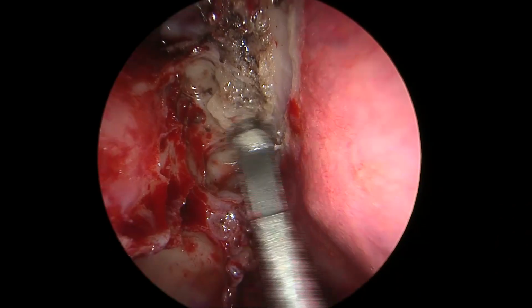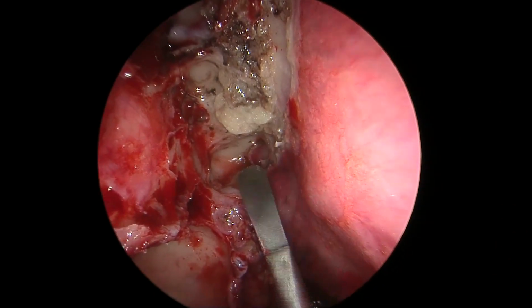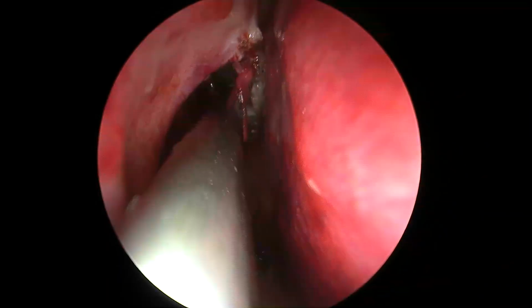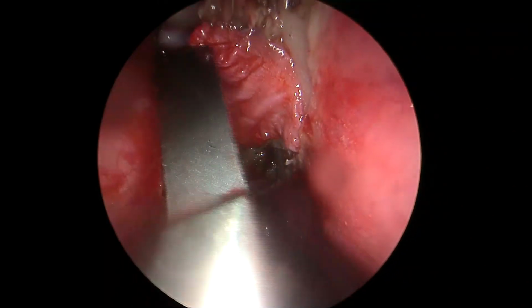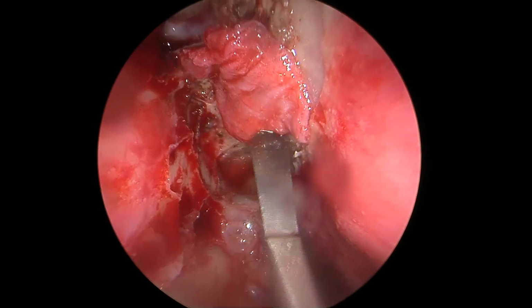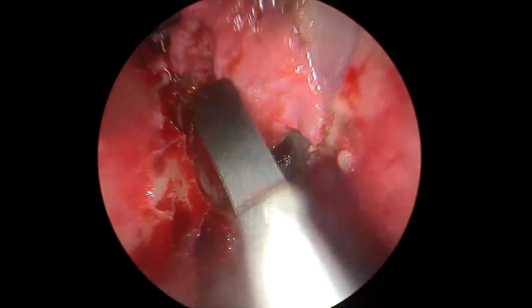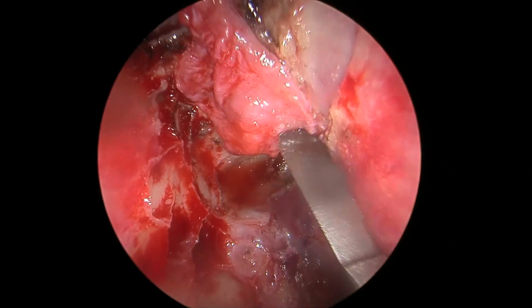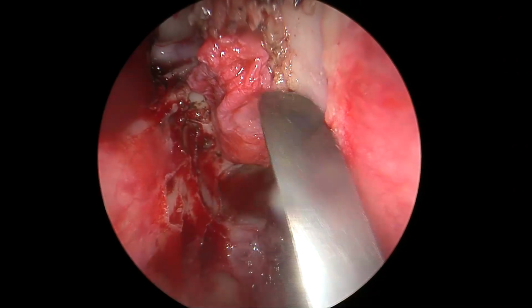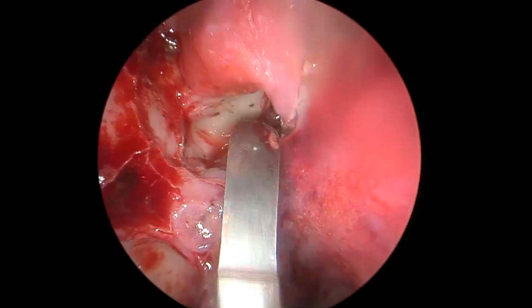Now that our fat is well set in the bony defect on the skull base, the next part is to put a fascia that is slightly bigger than the fat, over which we will keep a mucosal graft that is slightly bigger than the fascia itself, layer by layer. So you see, we have a relatively not too big fascia lata graft that we are placing onto this region. Mind you, this should not be sitting over the mucosa of the septum. That way it will never adhere. So this has to sit on the bare septal bone or cartilage and the bare bone of the skull base.